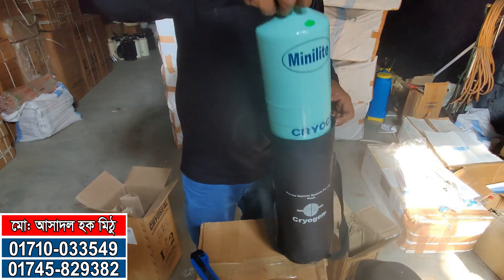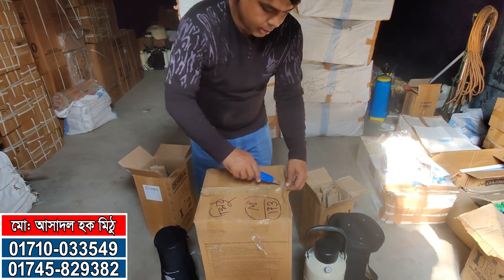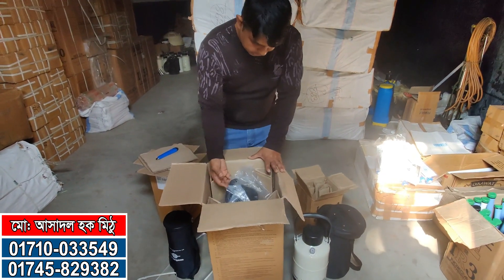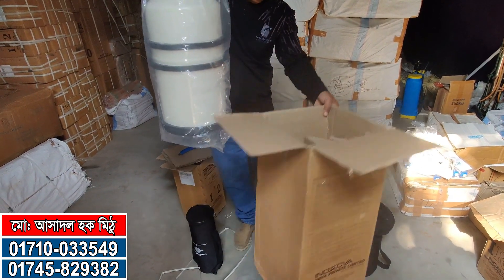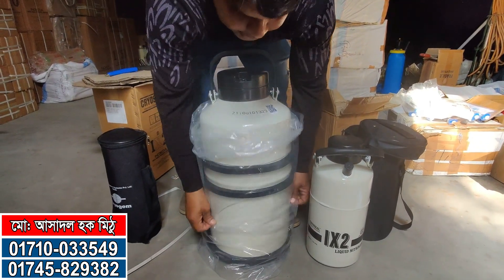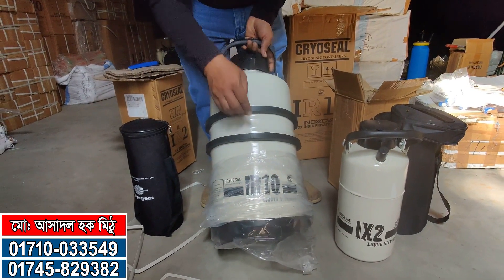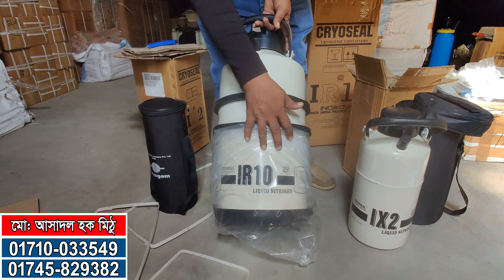Thank you, guys. I will show you this for 10 liters of nitrogen. This is the nitrogen can — I will show you how to do this. It's very good. This is the safety for the cows. The cows are safe. This is the IR10 Inox Company.